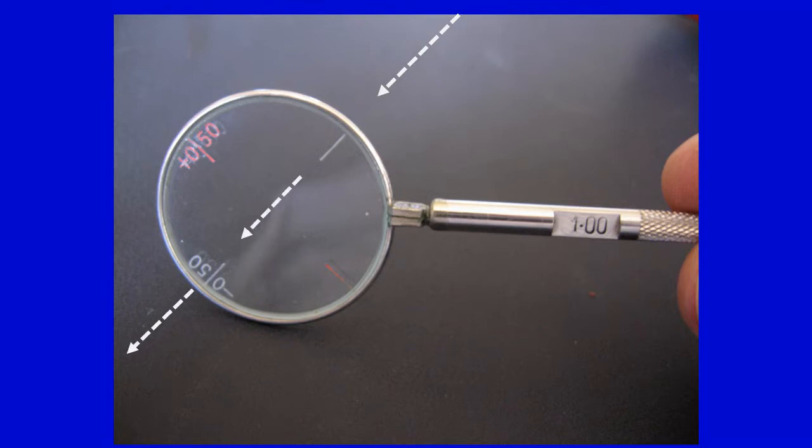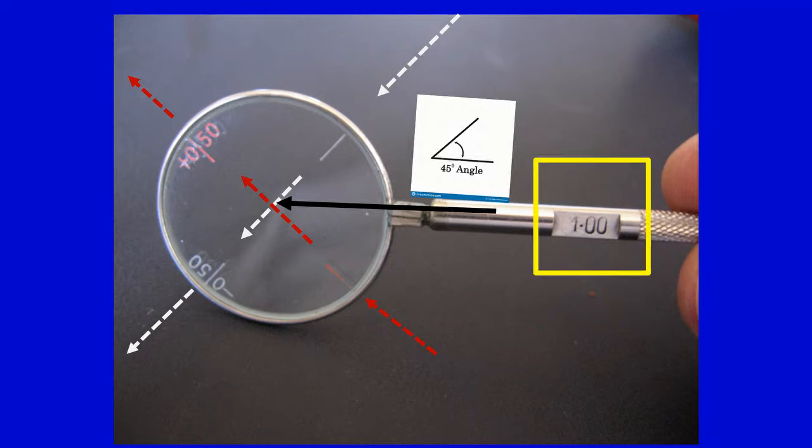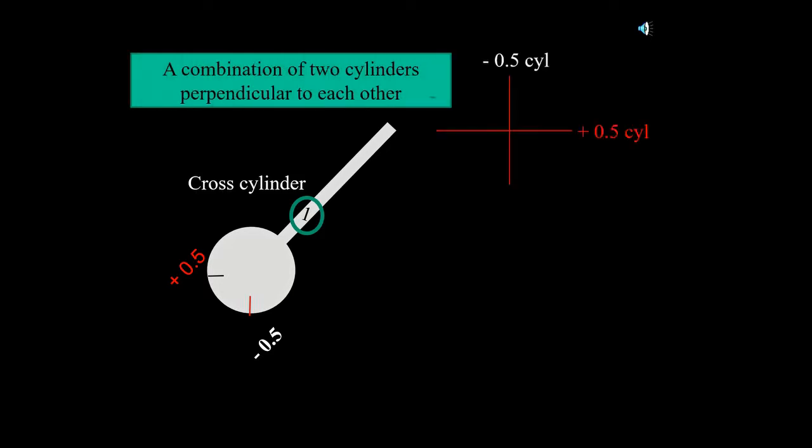This is a minus half cylinder. This is a plus half cylinder. This is the handle, formed 45 degrees to the axis, and the power of the cylinder is 1. So you can think of the crossed cylinder as two cylinders perpendicular to each other, of equal power but of different sign.